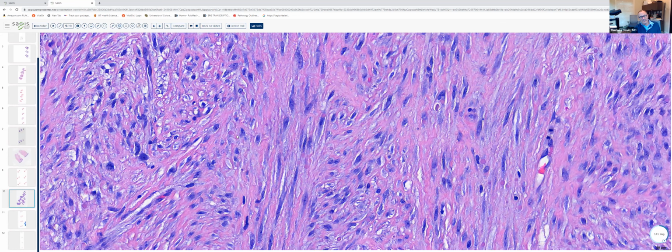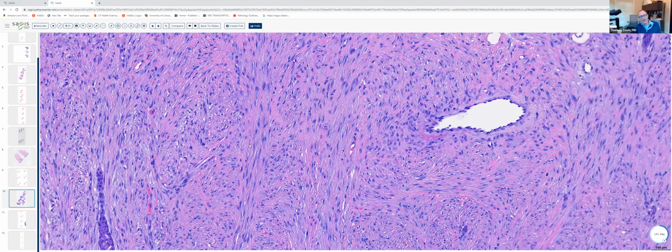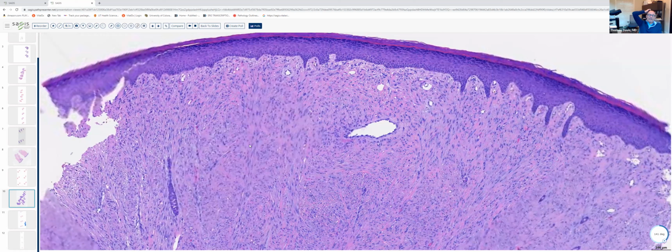These cells, as I indicated, are myofibroblasts, and the constellation of findings here is characteristic and pathognomonic of infantile digital fibroma or infantile digital myofibromatosis. Patients may have one or many lesions, and these can actually, if they're present in large enough number, be deforming.